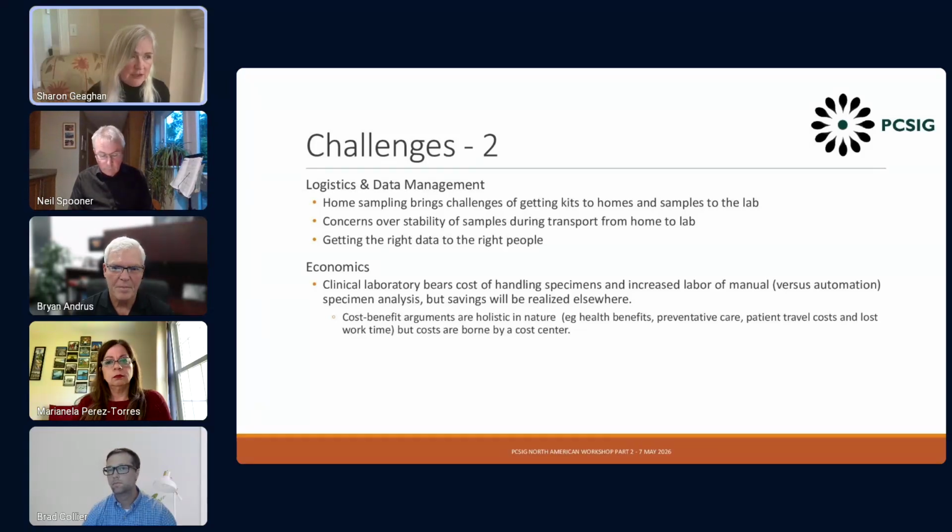The same way, there's an NHS program in the UK that is super interesting, which has validated urines that are both home collected as well as posted to the lab through the postal service. And they validated that for exploring C-peptide levels throughout Scotland first, to look for endogenous insulin production, and to basically find patients that have been misdiagnosed, that have young onset diabetes, but that are actually generating enough insulin that they can take tablets rather than face a lifetime of injecting insulin.